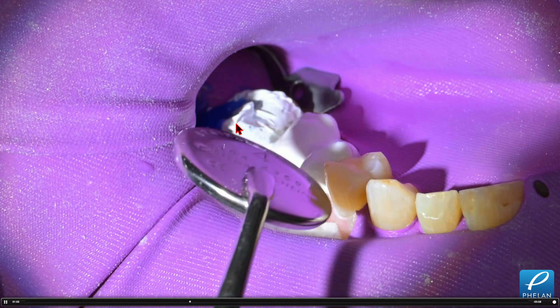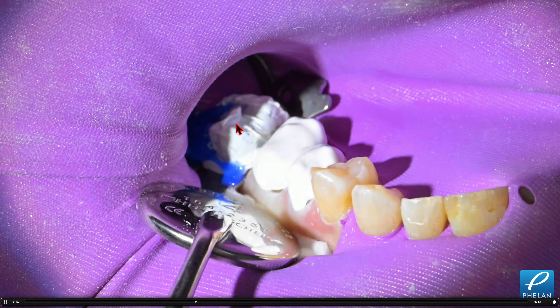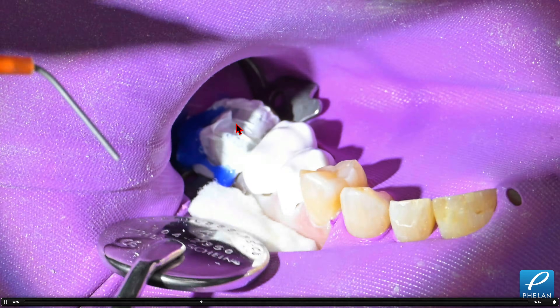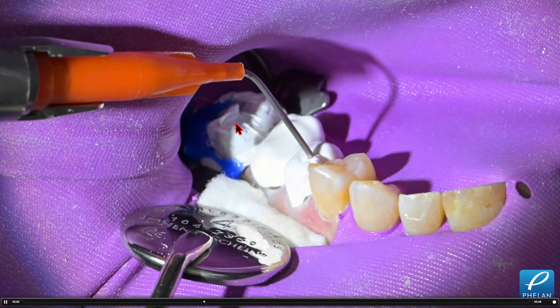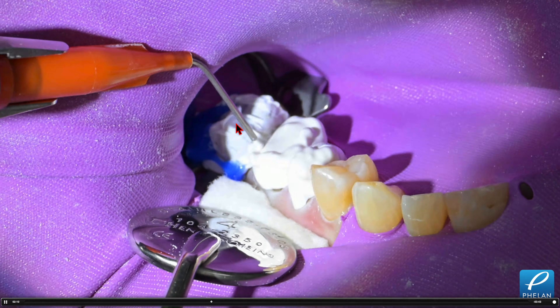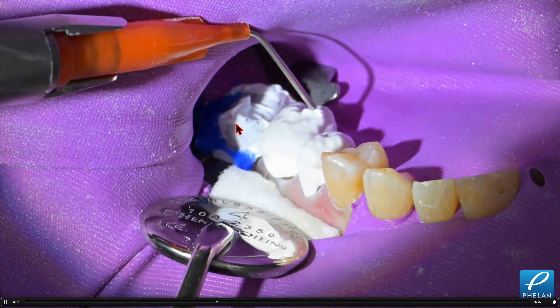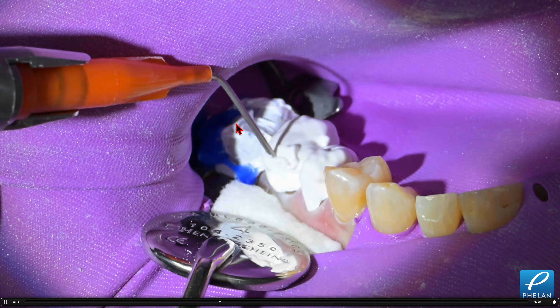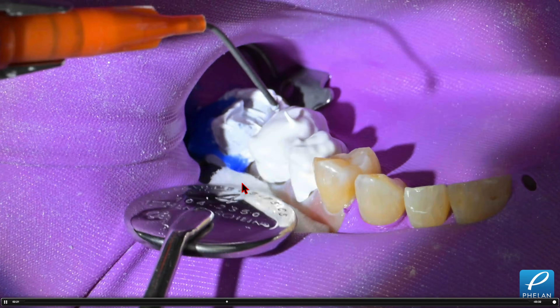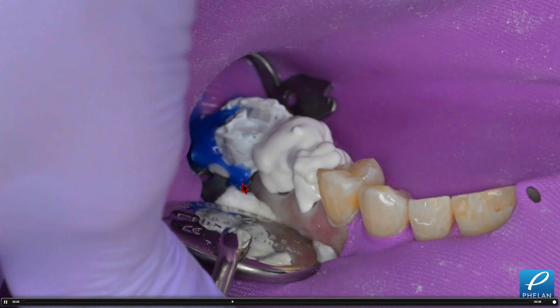Here I'm just stacking my self-cured Denmat core paste. If you look at my core buildup masterclass, we go through the technique in full detail — which adhesive I'm using and how we're mixing and stacking this. I've used this material for close to 30 years since I learned the basics from Dr. Bill Strupp. I modified it a little with a different adhesive system, but for the most part it's similar to Dr. Strupp's.